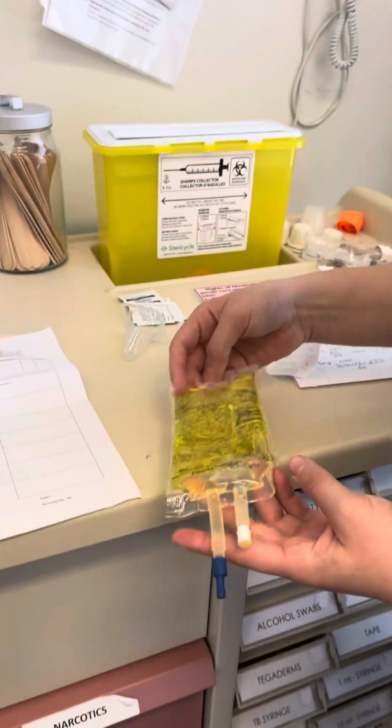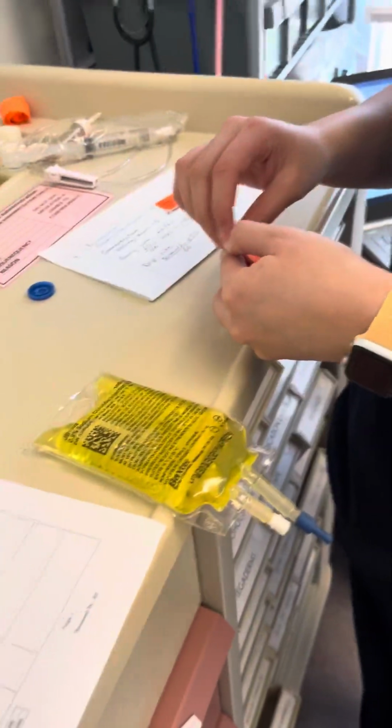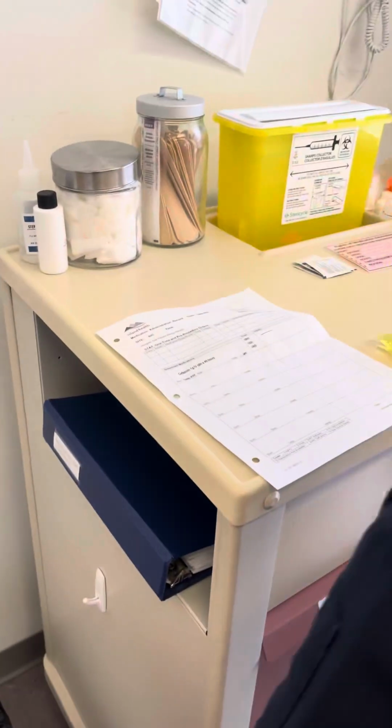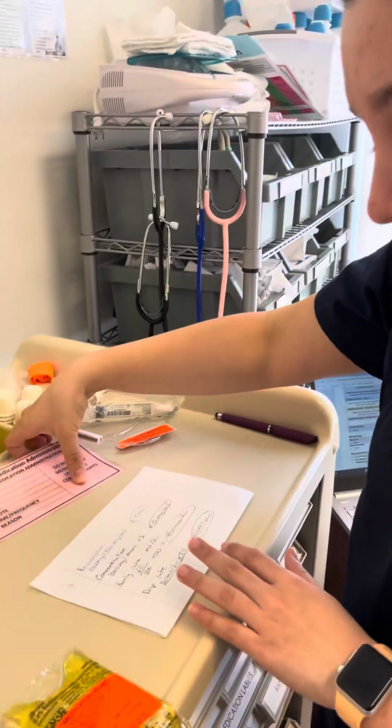Sharps. Hang that on the side. Label that. I'm gonna throw all my garbage out here. Okay, that's garbage too.